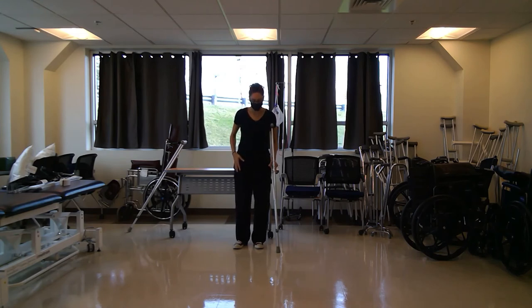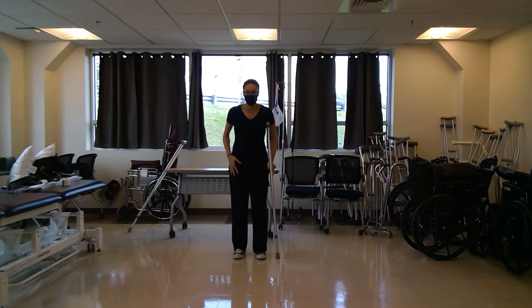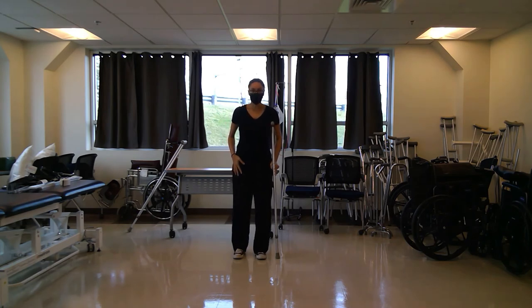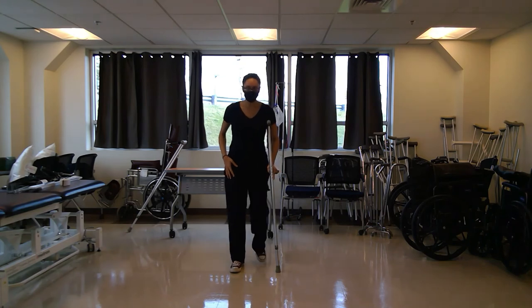I'm going to advance the crutch first, then advance my opposite leg — my right foot — and then advance your unaffected leg. So the pattern is: crutch, right foot, left foot.